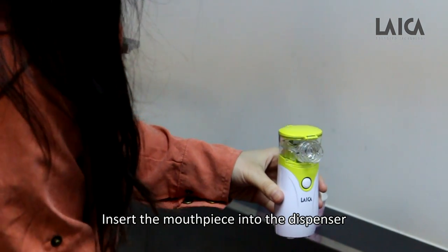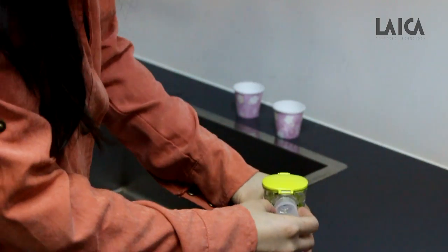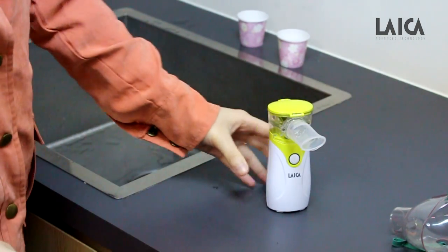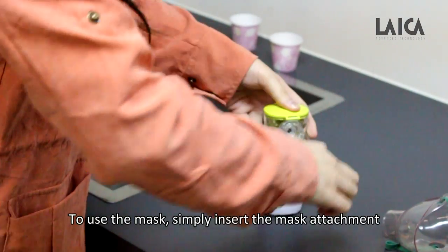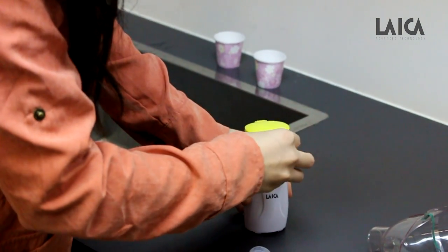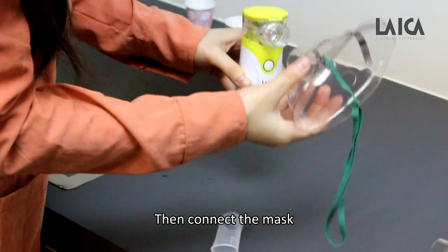Insert the mouthpiece in the dispenser. To use the mask, simply insert the mask attachment, then connect it with the mask.